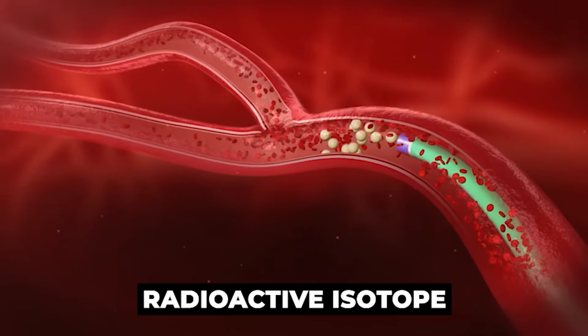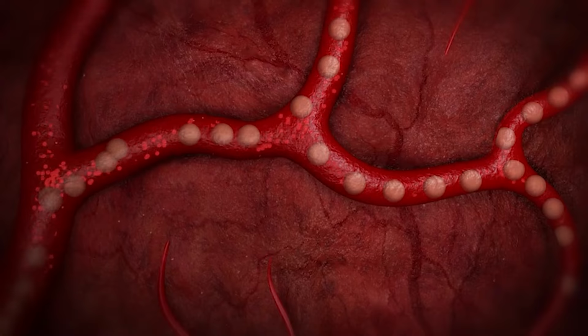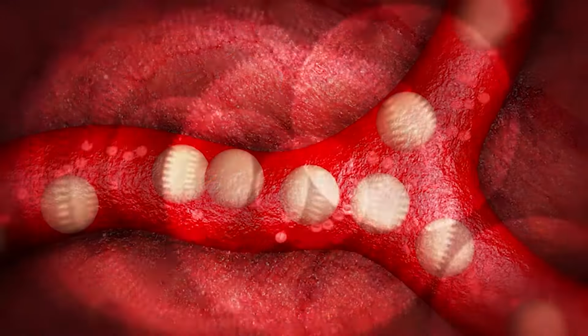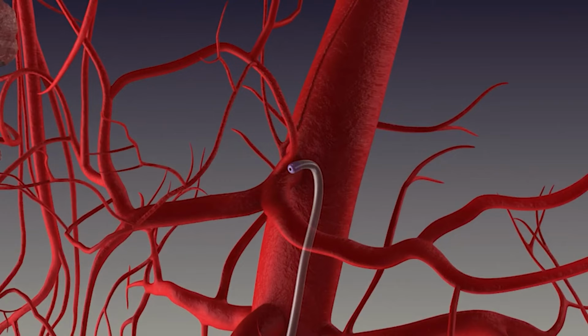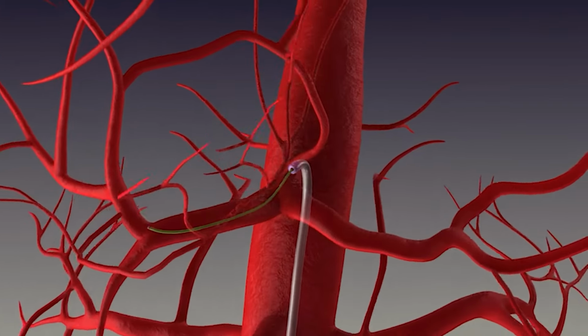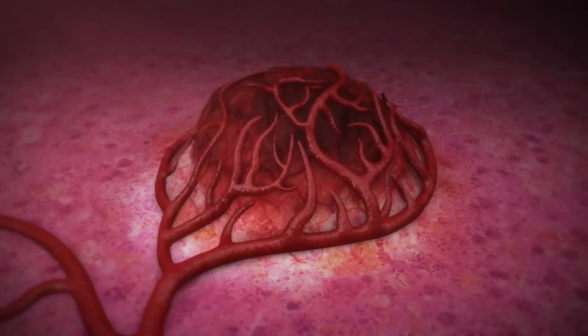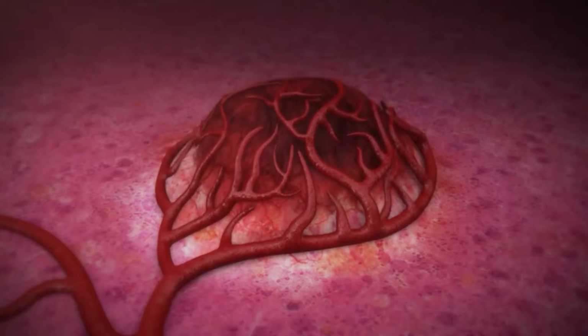So Y90 stands for yttrium-90, which is a radioactive isotope that is attached to these microscopic beads that look like little grains of sand. And these beads can be injected directly into the artery that's feeding the tumor. So once the Y90 is in the cancer, these little beads will release radiation over a very short distance, killing the tumor cells from the inside out, while sparing most of the healthy liver.